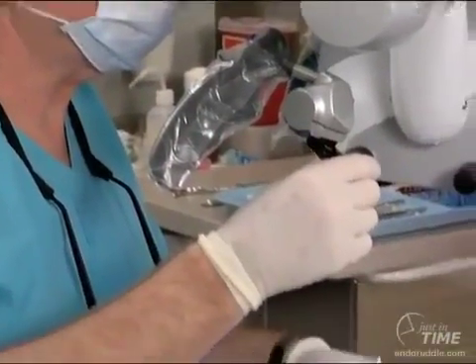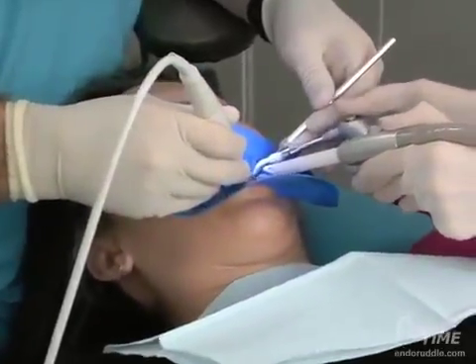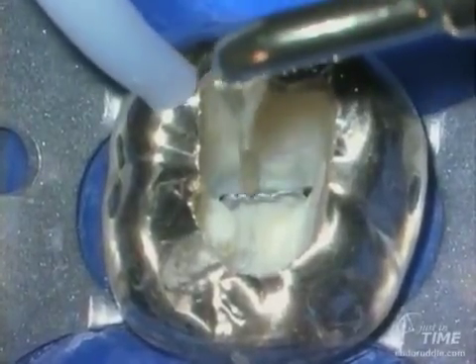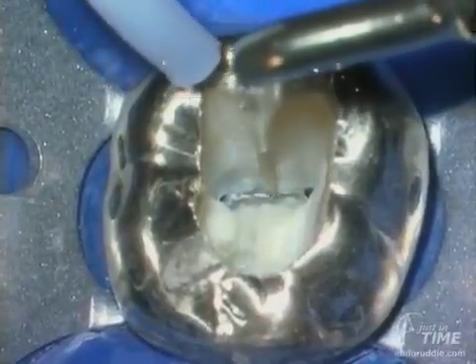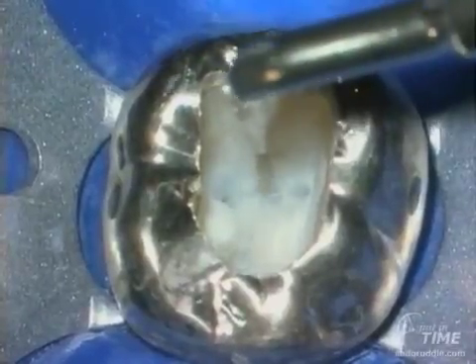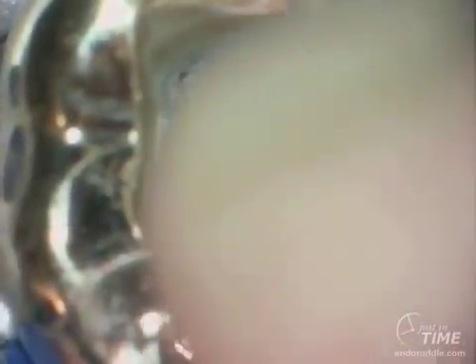Ultrasonic technology is playing an increasing role in access cavity refinement. Here we're using a pro-ultra tip, dry — the air blows out the byproduct of our sanding action, which is dentinal dust — and we run along between the MB and ML interconnector. Within this groove in mandibular molars, one can occasionally find a mid-mesial system. If we never explore for this, we'll never find it. Remember that when you have a mid-mesial, it's right against the depth of the furcal side concavity, so we must shape this canal smaller than we would actually prepare the MB and ML systems.